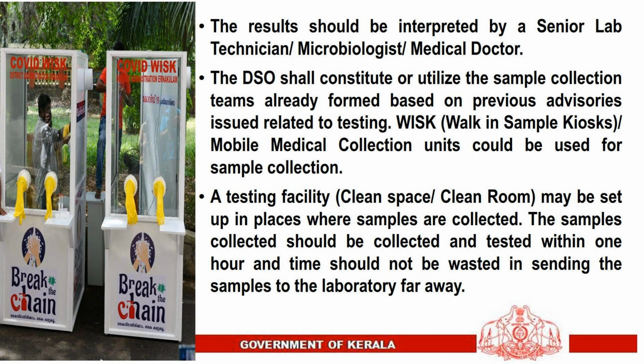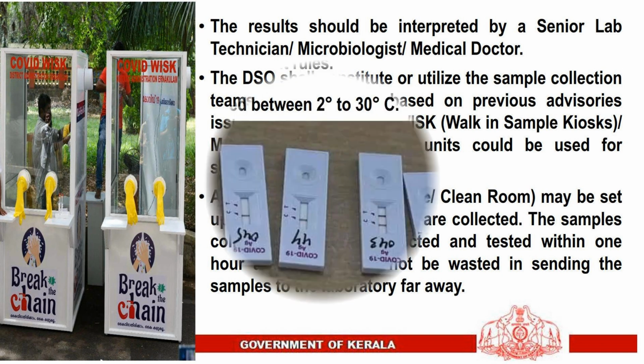The DSO shall constitute or utilize the sample collection teams already formed based on previous advisories issued related to testing. Walk-in sample kiosks or mobile medical collection units could be used for sample collection. A testing facility, clean space or clean room, may be set up in places where samples are collected. The samples should be collected and tested within 1 hour, and time should not be wasted in sending the samples to a laboratory far away.